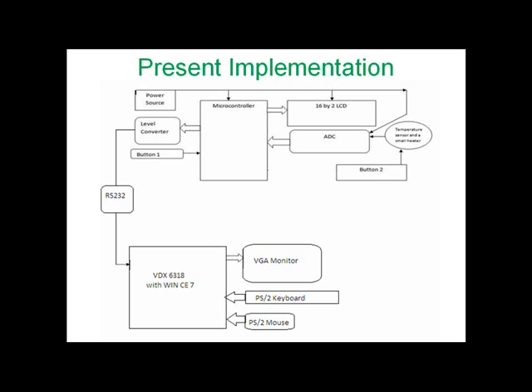When moving on to the next reading, the user has to wait for the thermistor to cool down to room temperature for 2 seconds. Before the user presses the response switch for the 21st time, the user has to press the connect button on the foot map application program, which is a graphical user interface running on the VDX6318 processor based on x86 architecture. After the completion of reading, the last press of the response switch transfers the recorded value to the VDX6318 processor.